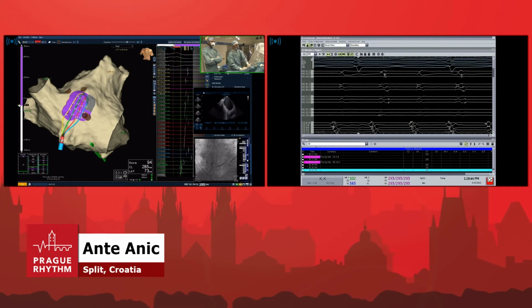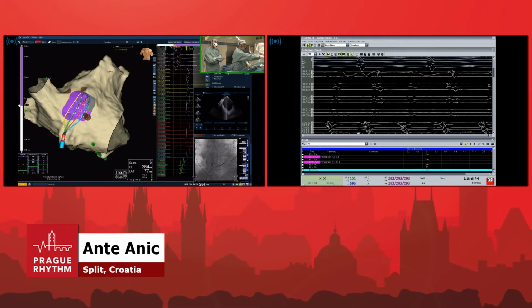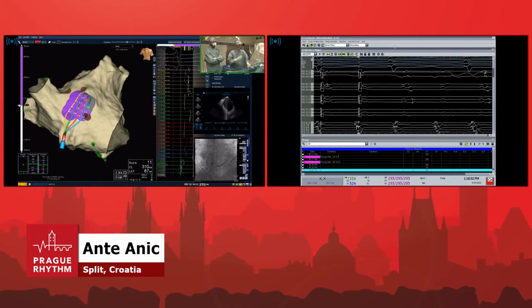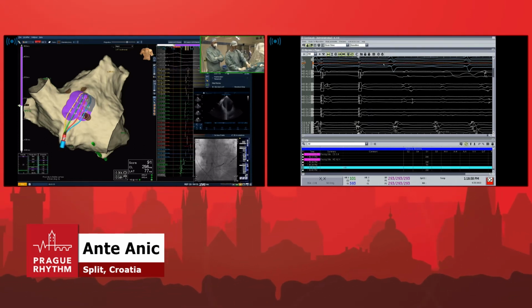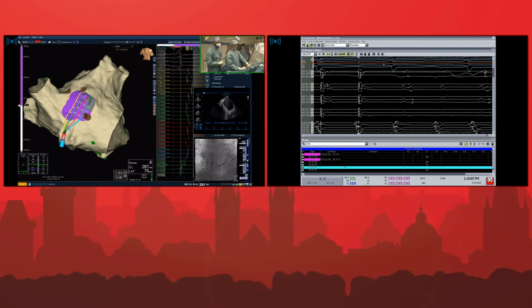Okay, guys, leave us here because we have to map this arrhythmia, but it's very likely that we're going to have to perform additional ablation with Farapulse in that anterior part as we suspected. So now we're going to do a left atrial map, and can we move to another lab after that? Yeah, thank you. So set up the window for mapping. Okay, we're doing mapping. Good.